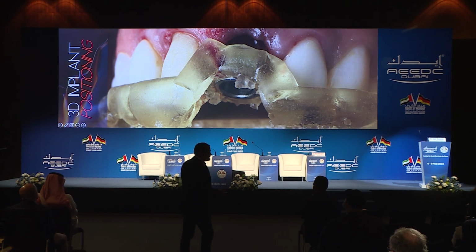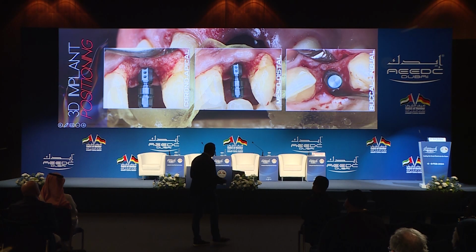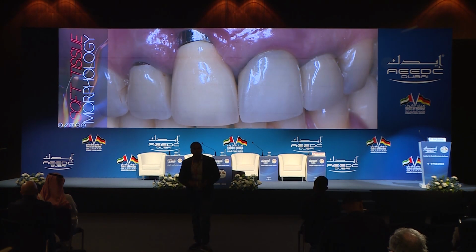It guides you to place your implant in an ideal 3D position. You just have to do the right planning, especially if you're doing immediate, because it's very challenging when you're drilling into the palatal bone, as the drill pushes you to the buccal side. So you have to fight against this. Here, it makes things really easier. And today the technology is super safe. If you do the right planning and the right guide, you can place your implant in the right position. Number 3, soft tissue.